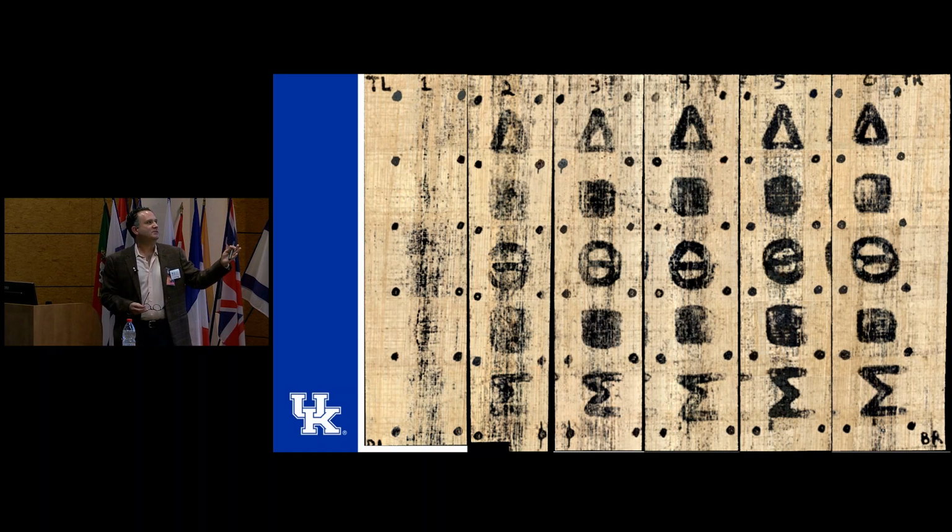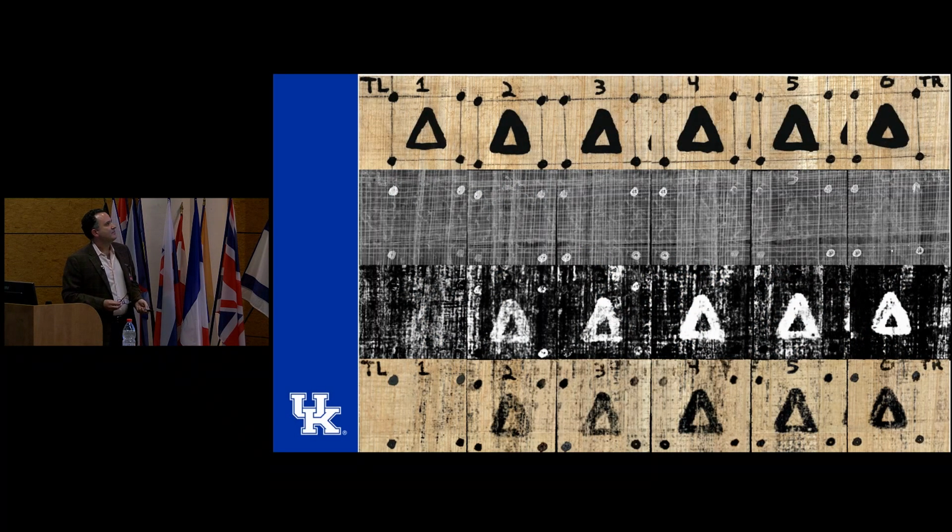If you look closely, it is identifying and picking up on the pattern of the fibers themselves and doing a decent job at recreating that as well. Just an overview of what you've got here with this essential training based on our phantom. Top row, we have the phantom, we have the CT, we've got the output of the neural network, and then this photorealistic regeneration of it.